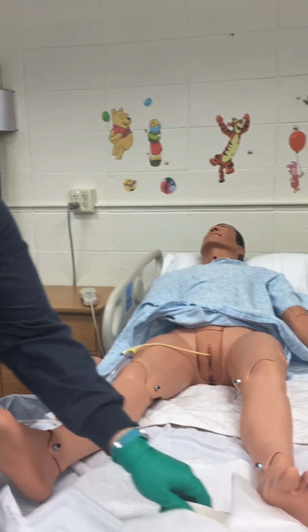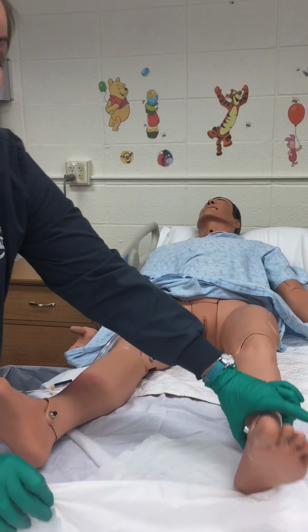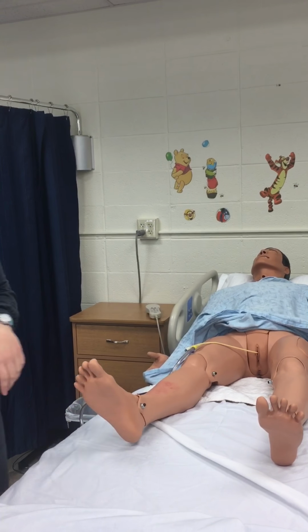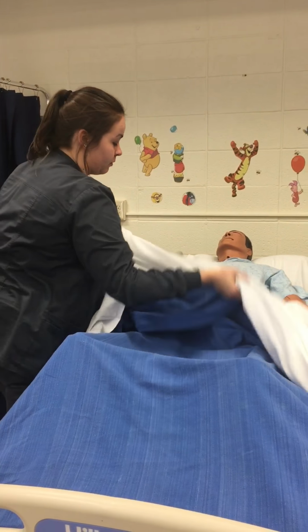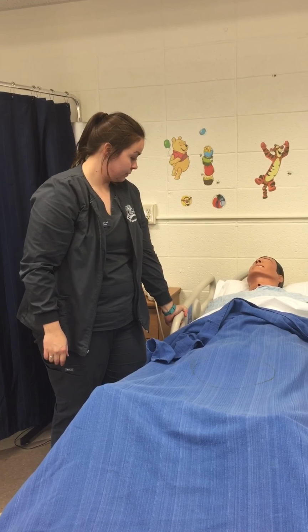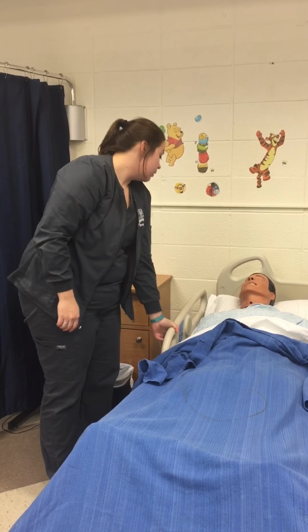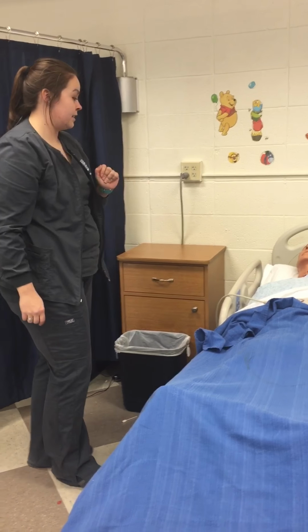I would remove my supplies, remove my gloves, cover the patient up, lower the patient to a safe height, making sure their call light is in reach. I would ask them if they needed anything, and if they didn't need anything else, I would leave the room and go document my procedure.